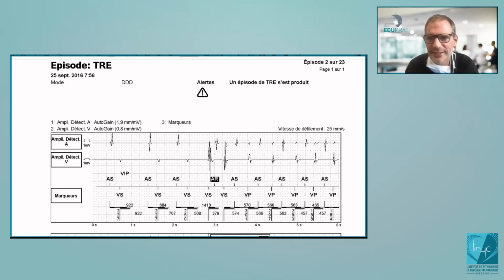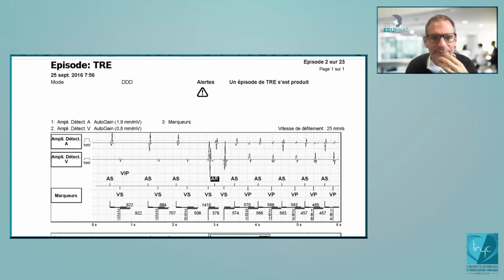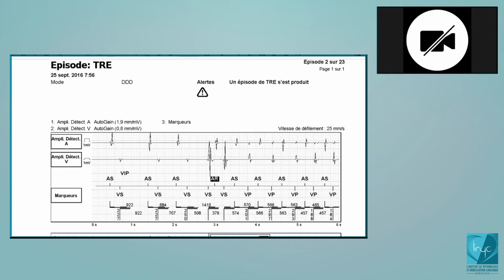Yann, are you there? Yann Charton, are you there? Yes. Yes, Yann. What do you think about this? I'm sorry it's in French, but it's about the same. So it's a double chamber pacemaker. Yes. It's a recorded EGM. Yes. It's programmed in DDD. Yes. And we see on the beginning of the tracing.